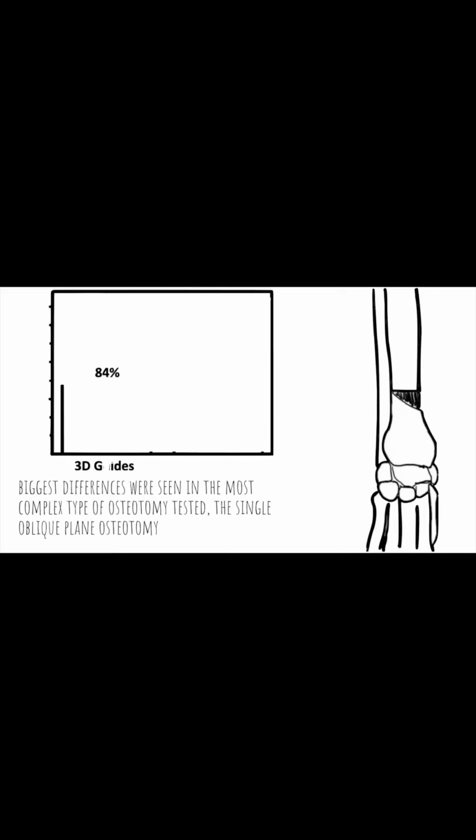The researchers established a clinically acceptable threshold of being within 5 degrees of the target angle. Overall, 84% of the osteotomies performed with three-dimensional patient-specific guides were within this 5-degree deviance from the target, compared to only 50% of the freehand osteotomies.